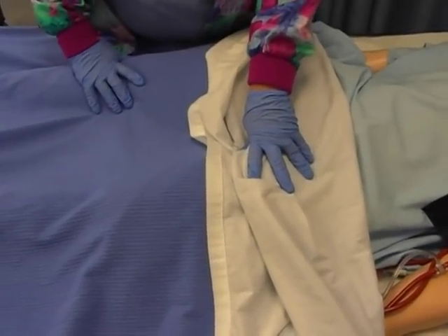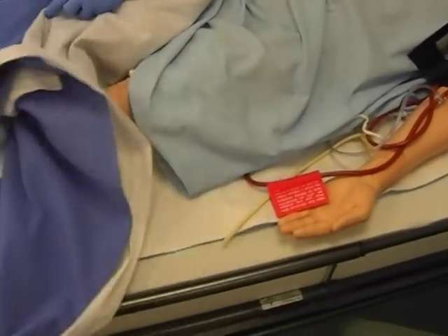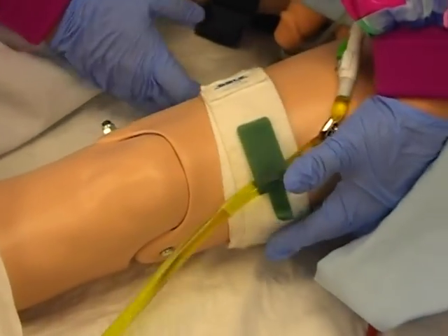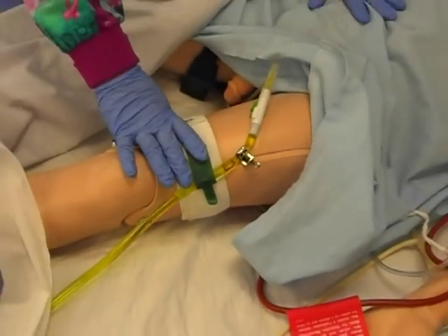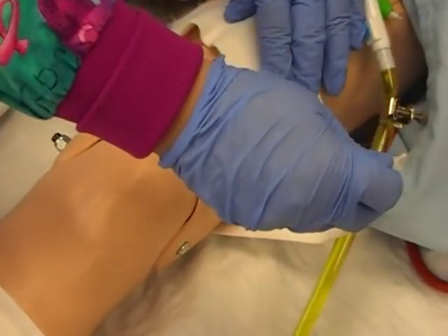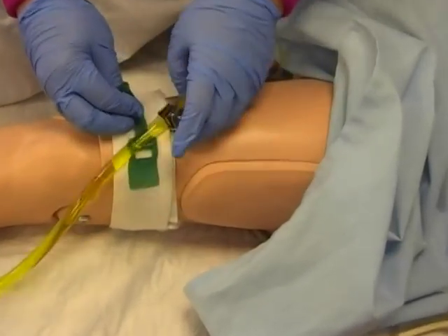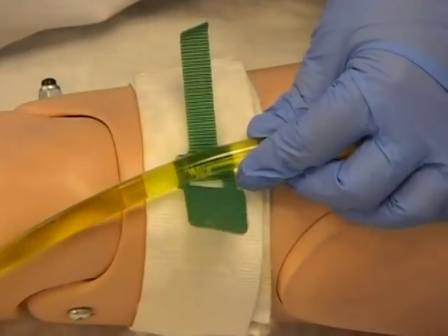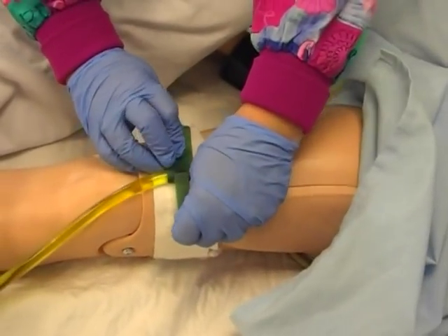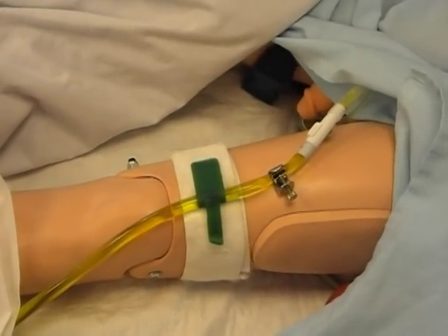First of all, I want to show you that whenever you put a catheter in or somebody has a catheter, you want to make sure that you put what we call a leg band on the person. That leg band simply makes it so that the Foley is not tugging whenever they move. On a person it would actually stay. It just goes around and you connect it with velcro so that it stays in place. Every facility has a different one, so it's going to look a little different each time. You just make it snug and secure, velcro it on, and that keeps the Foley from tugging and causing trauma within the bladder.